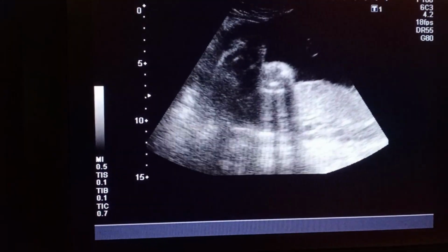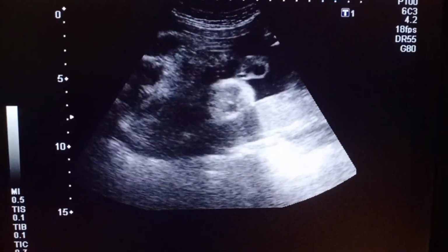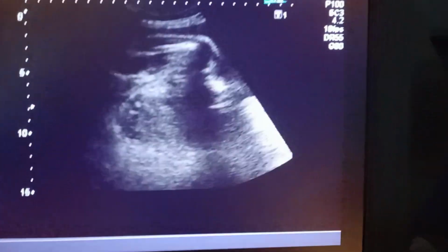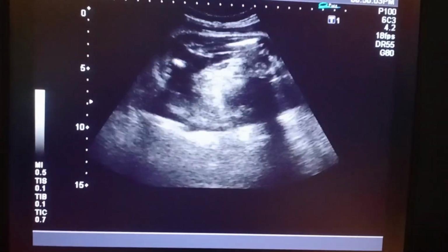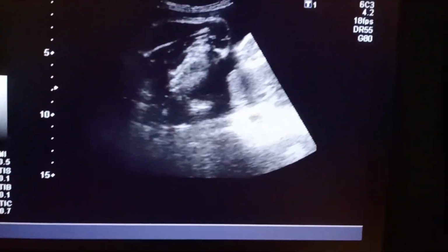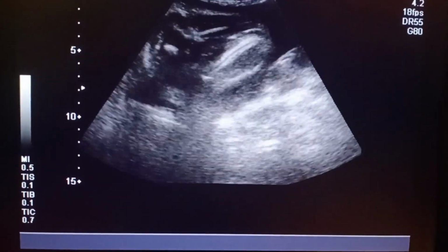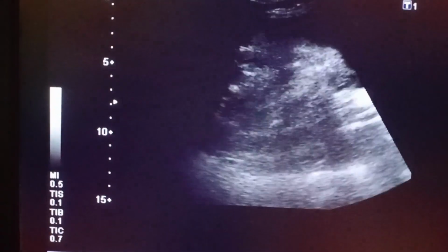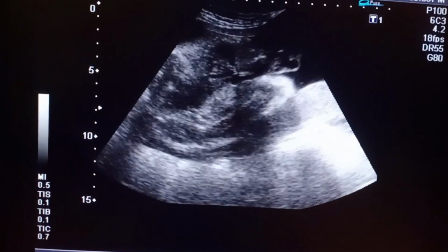I'll focus on the female genital multiple times so that you can identify it. So look at the burger sign. It's just like a burger that shows both the labia, and in between them there is a line that is just like the shape of a burger.